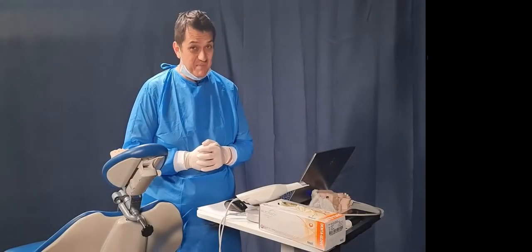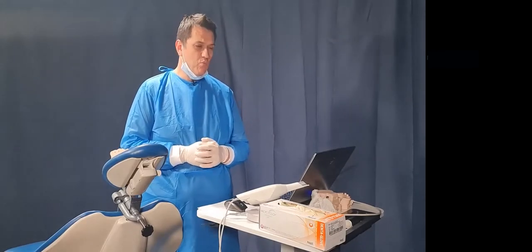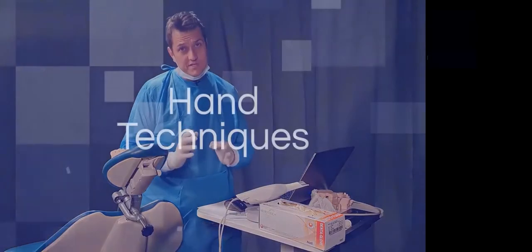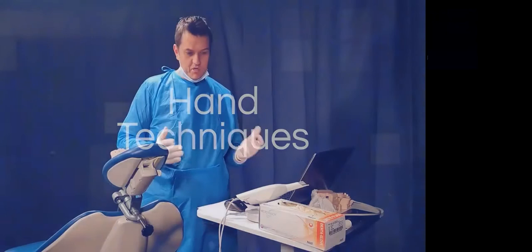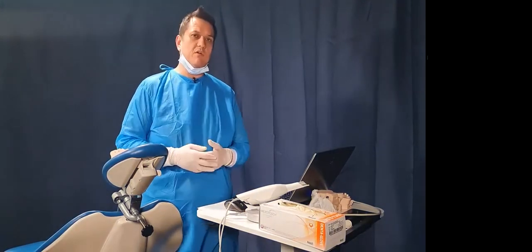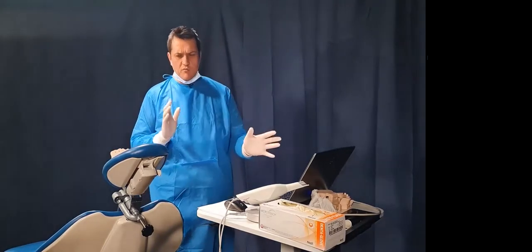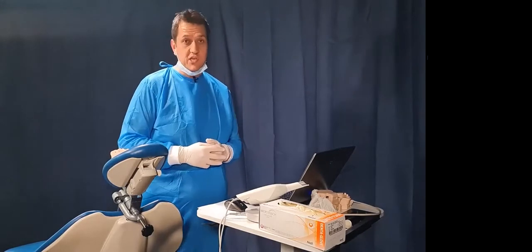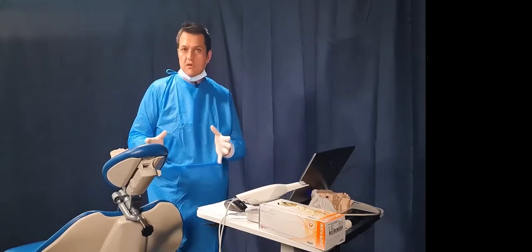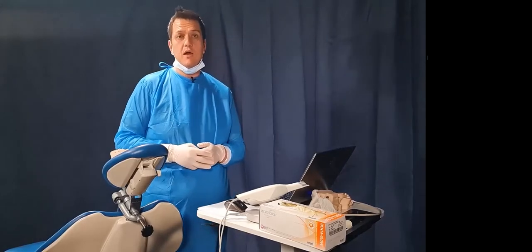Okay, let's jump straight into the practical component of our webinar today. We're going to look at a few things, and the first thing is hand techniques. If you were with us last week, you would have heard me talk about posture, computer position, scanner position, and patient position in relation to you. I am a big advocate of frontward facing scanning, specifically for denture indications. Let me clarify that. Because you can really see the anatomy head on, whereas if you're behind the patient, sometimes it's quite tricky to see the anatomy and what you're doing.